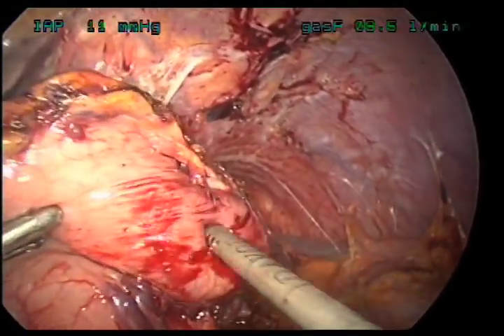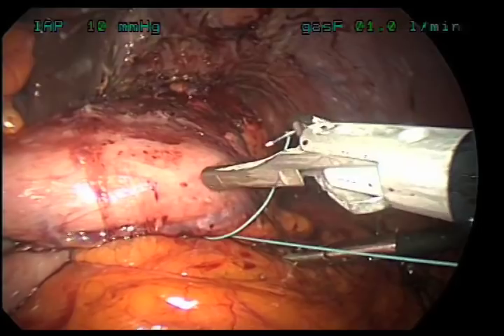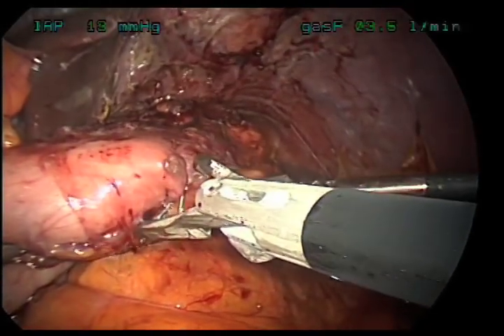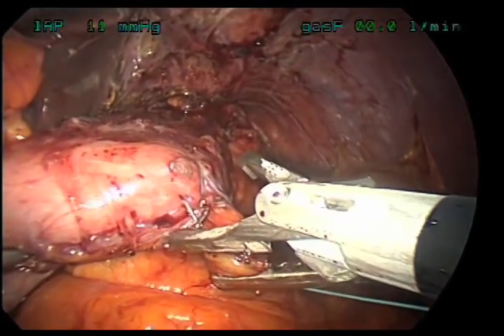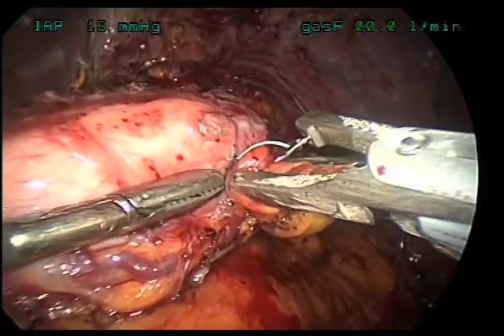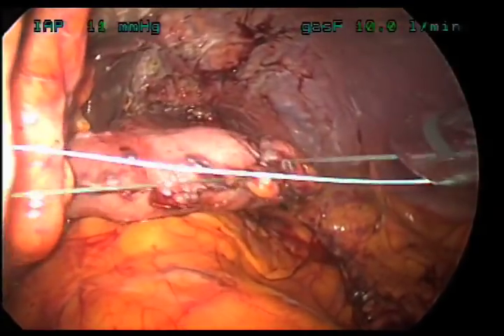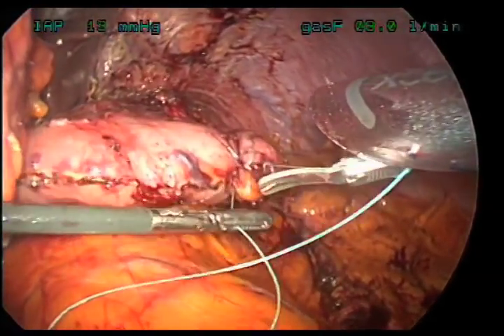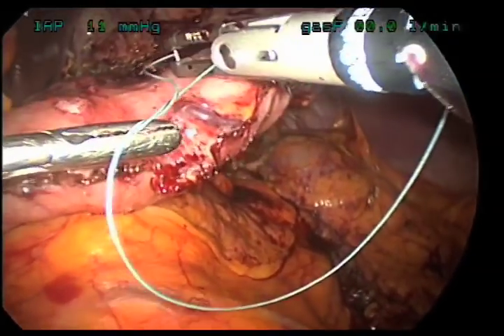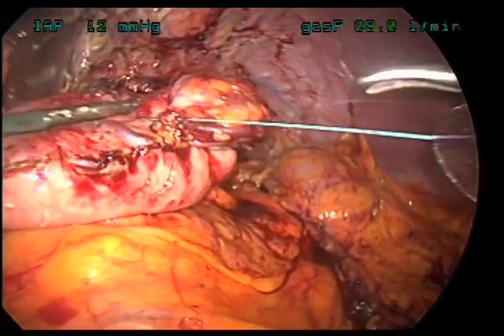Once we've finished taking down all those short gastric vessels, we can now begin the part of the operation called gastric plication. Here we're starting the imbrication portion of the surgical procedure. What we're doing is taking big bites of the stomach and pushing that greater curve — the outer portion of the stomach — in on itself. This stops the stomach from expanding when you take large meals, so you get full eating very small meals. We're doing this with the aid of a device called the endo stitch, which allows us to suture in the abdominal cavity very easily.